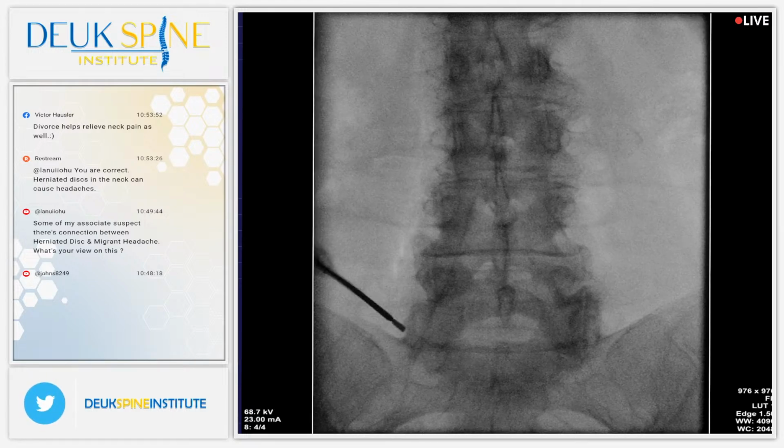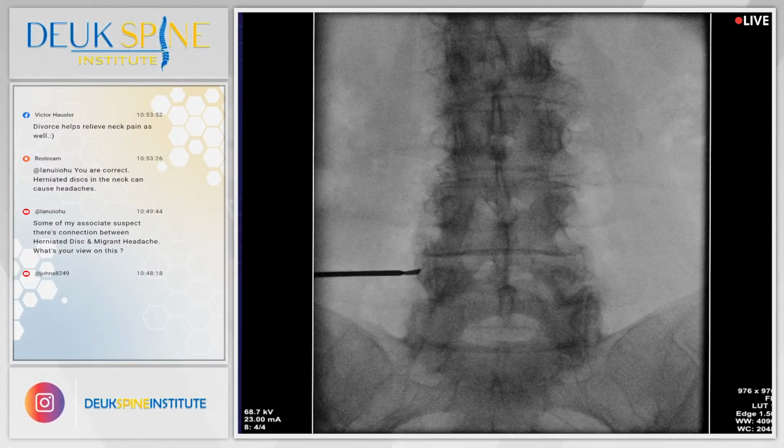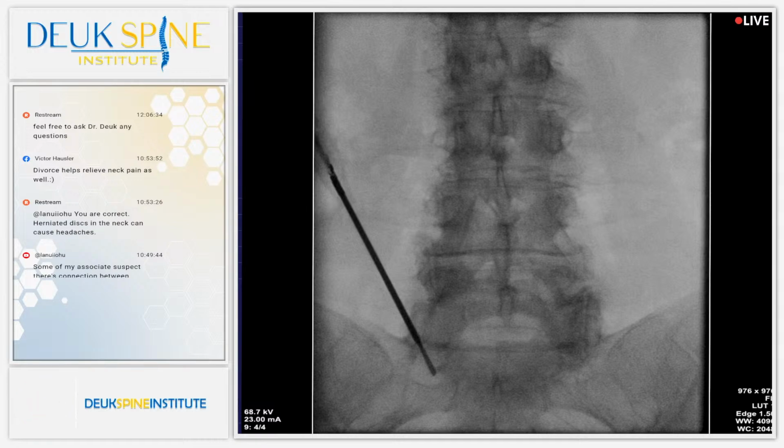So you can see from our video that there are little nerves that need to be targeted and treated. Shot. And those nerves are pain nerves called medial branch or dorsal ramus, and their exact location can be determined on an x-ray machine, which is what we're doing right now. We're using the x-ray machine to target them. I can feel the pain nerves being cut when I do the surgery. All right. Now, my next target is down there at the bottom of the L5 S1 facet.